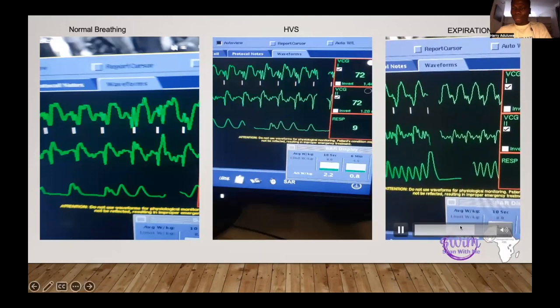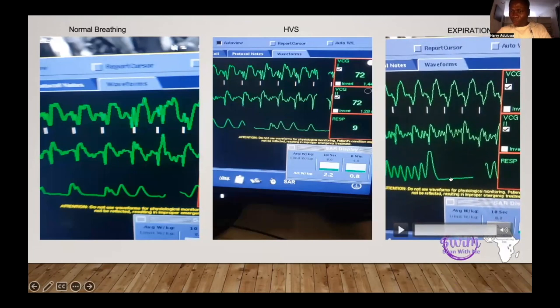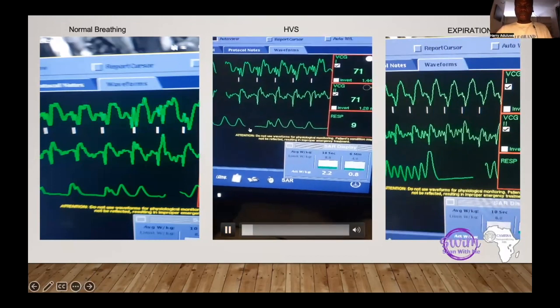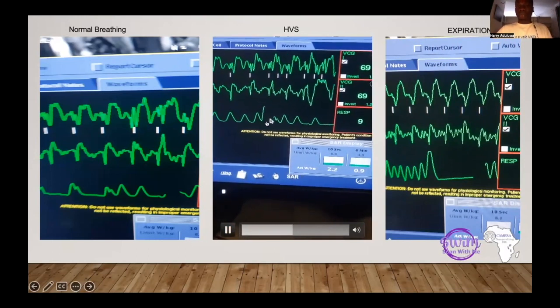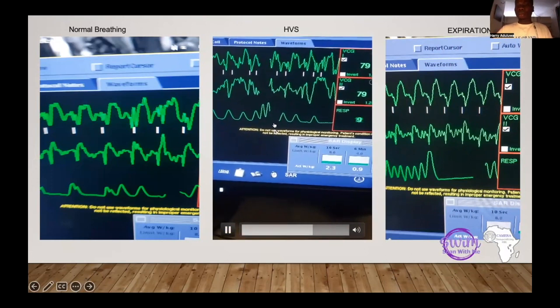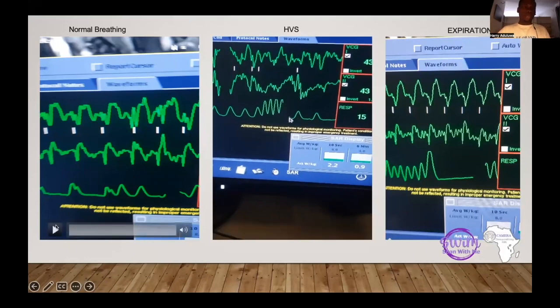Yeah. Now, see, when the patient is holding their breath, this is what you have. Just clear. And when you're doing your normal imaging, breathe in, breathe out, patient hold your breath after breathing out, this is what you should have. There should be no spiking. Clear, for the few seconds you are going to run that sequence. This one breathes with the beep. See how it's going? So that is the hyperventilation sequence. This one is the free breathing.